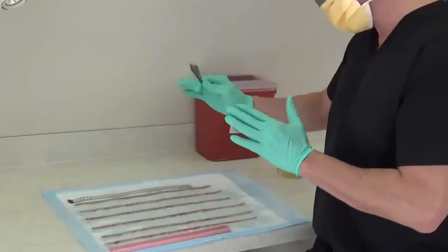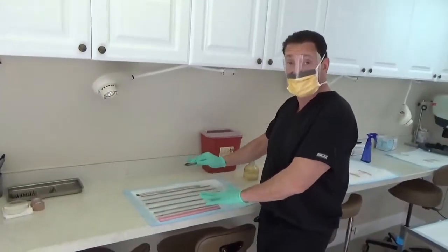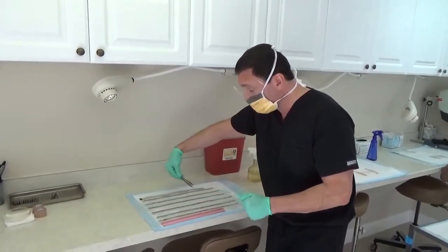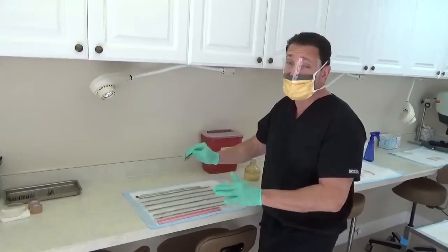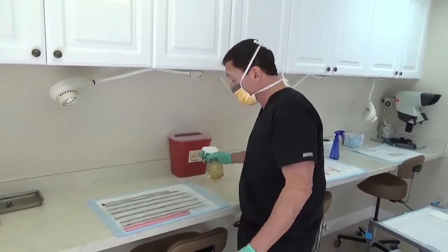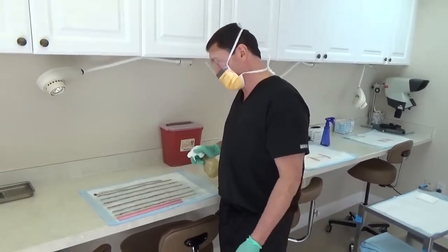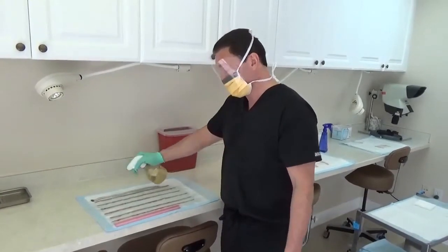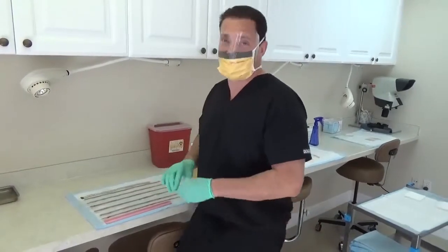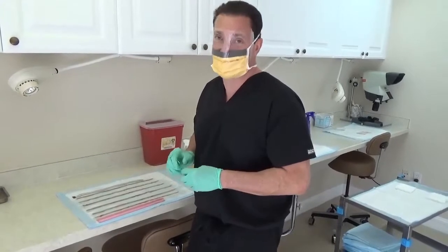This is approximately 80 centimeters. If it was perfect grafts, it'd be about 16,000 hairs, but because he had the follicular unit extraction, there are some areas with holes, so I'm going to lowball it and say about 15,000 hairs. Compared to his last procedure where he got about 1,500 hairs at best, of which only half grew. So he didn't even get 10% of what you got today. Correct. And he sat in a chair for 12 hours. They decimated his donor.